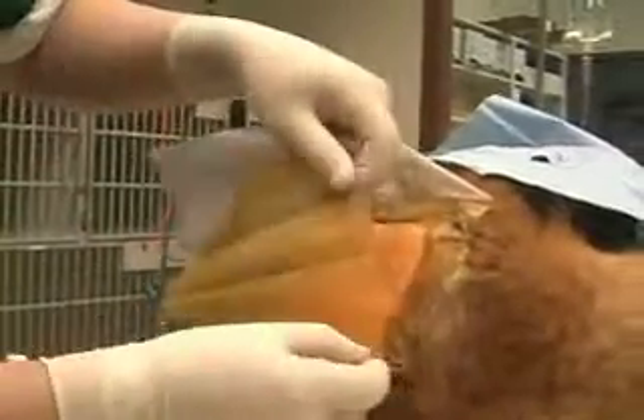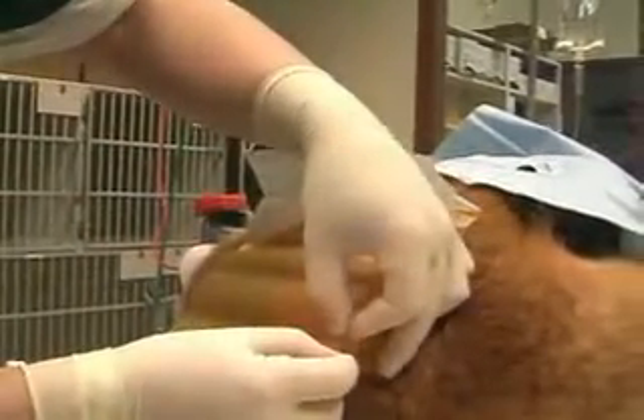We're going to apply one sheet of material — Ioban.